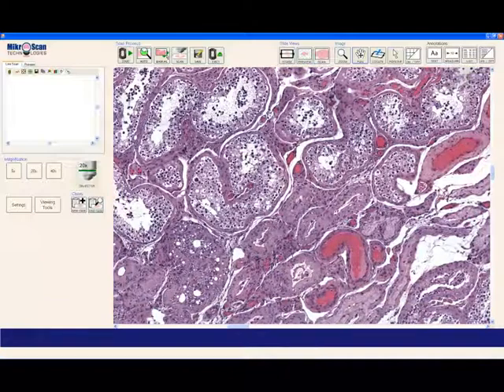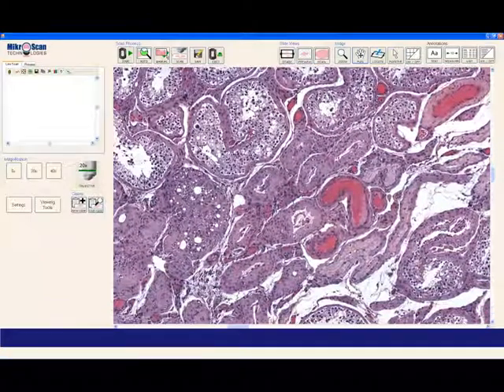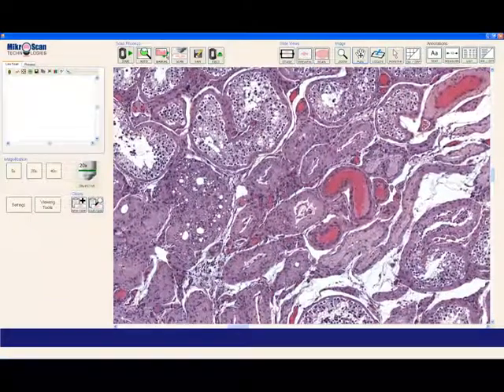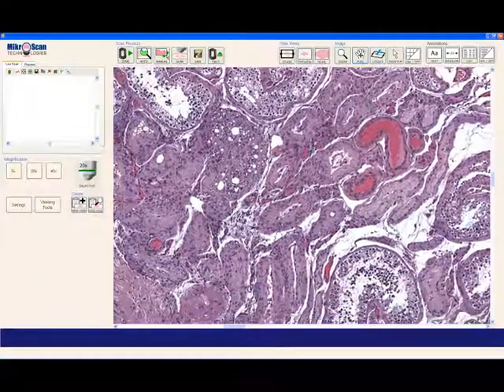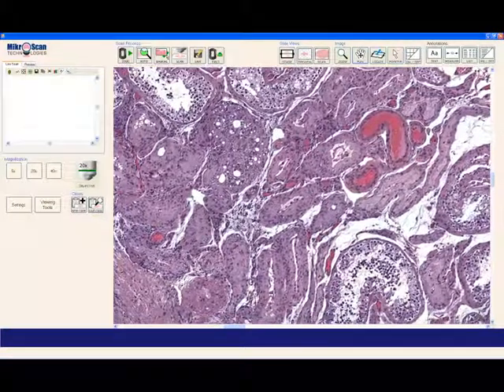To see more than the current field, you'll want to use the Pan tool, which allows you to traverse the entire image if necessary.